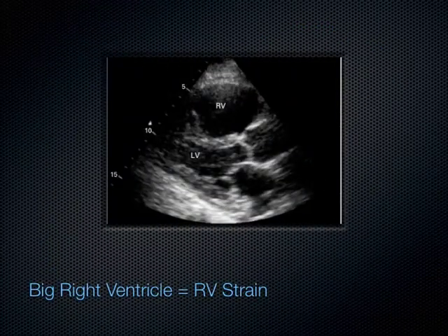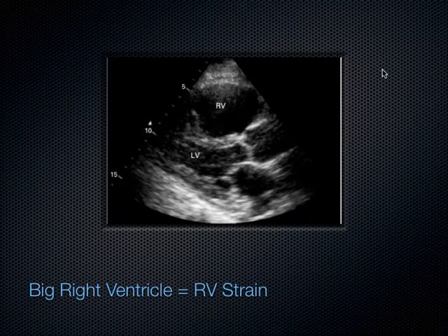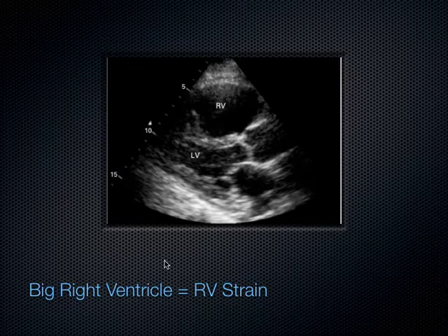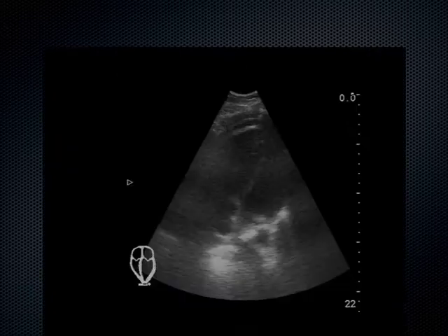Here's an example of RV strain in the parasternal long axis: left atrium, left ventricle, aortic outflow tract, and the right ventricle — which is clearly bigger than the LV. Normally the RV should be two-thirds the size of the LV. With massive pulmonary embolism, the RV is trying to pump against the clot in the pulmonary artery — blood has nowhere to go, so the RV gets bigger and bigger. This makes complete logical sense.